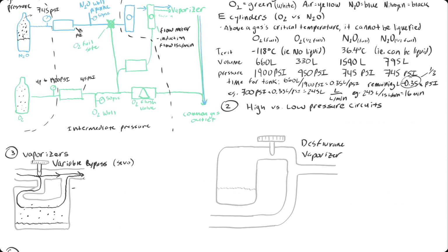This works because SEVO is a liquid at room temperature. It's liquid and it boils at 58 degrees Celsius. Which means that at room temperature, it will be a liquid, and any liquid in an enclosed space actually does have a predictable amount of that substance in the gas form above it. The saturated vapor pressure of SEVO is going to be about 160 millimeters of mercury at room temperature. So knowing that there's this somewhat reliable concentration of SEVO in the gas phase in this container, it can send the air through and pick this up and output it.